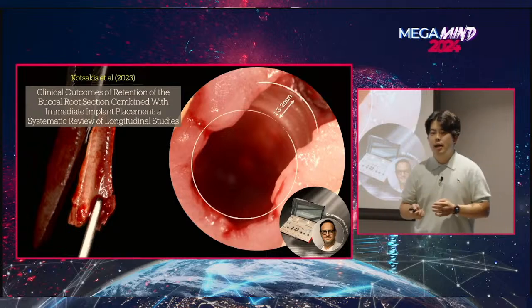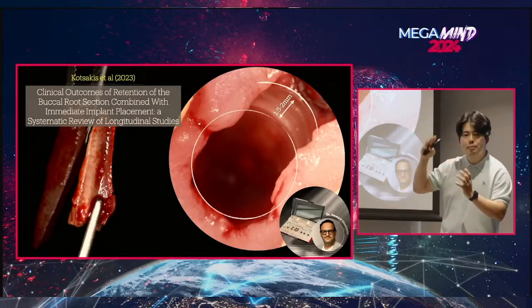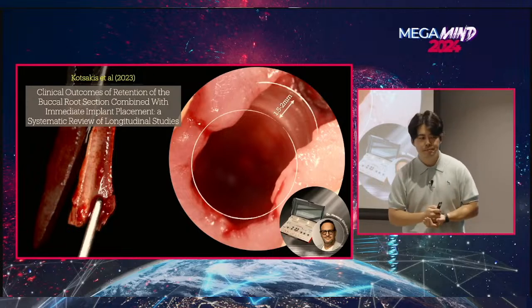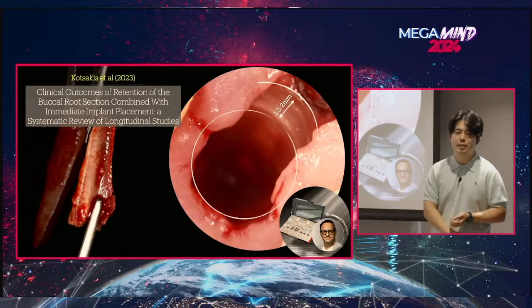Now, as the literature recommends, we create the shield to create optimal stability, and crescent-shaped in order to provide maximal space for the implant. And we add an internal chamfer, creating room for the tissue. And once it's created, this is what it looks like. And now it's time to place an implant.